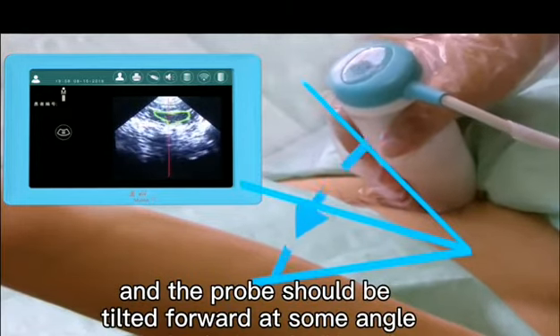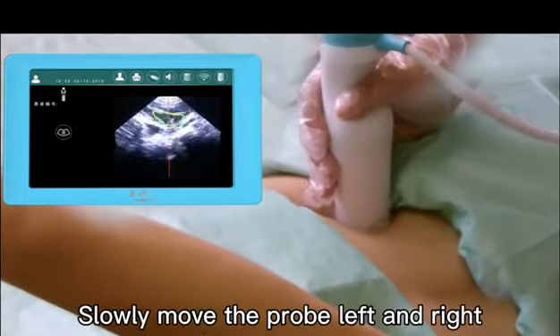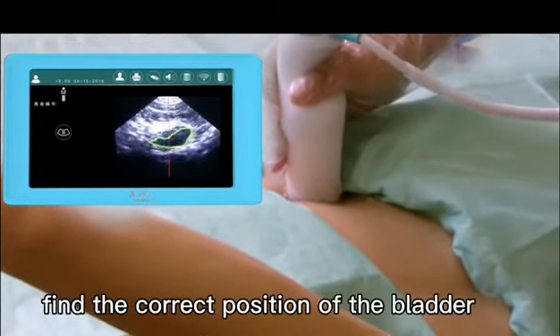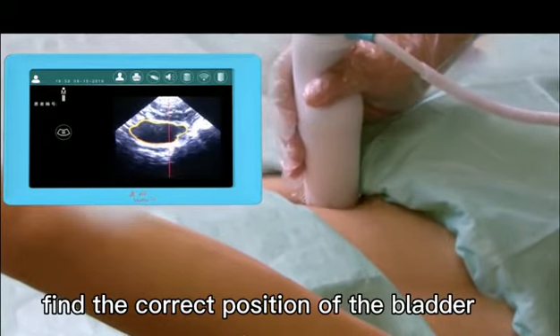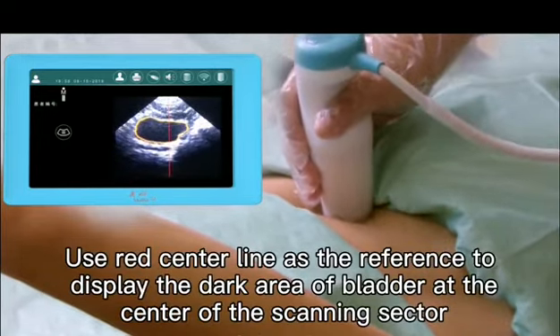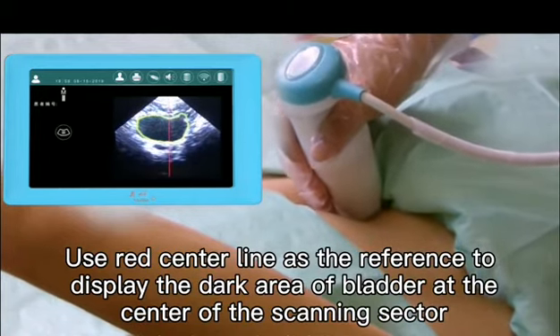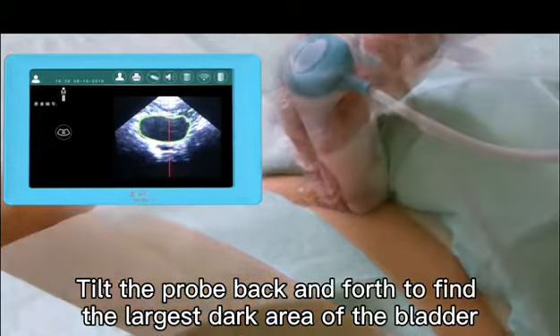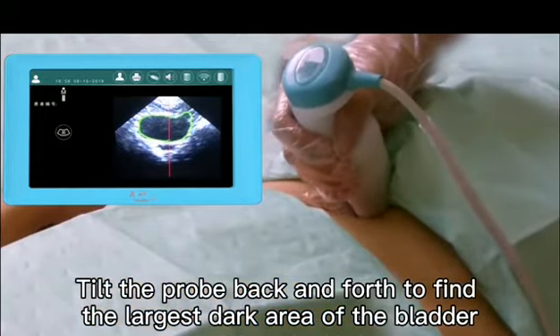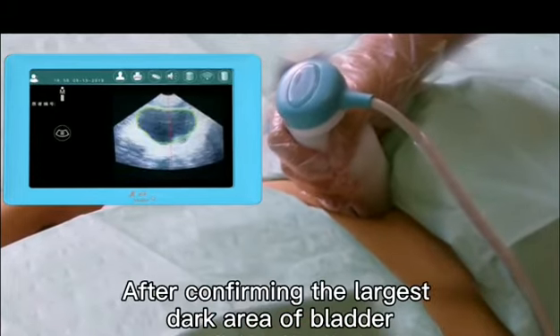Slowly move the probe left and right to find the correct position of the bladder. Use the red center line as the reference to display the dark area of the bladder at the center of the scanning sector. Tilt the probe back and forth to find the largest dark area of the bladder.